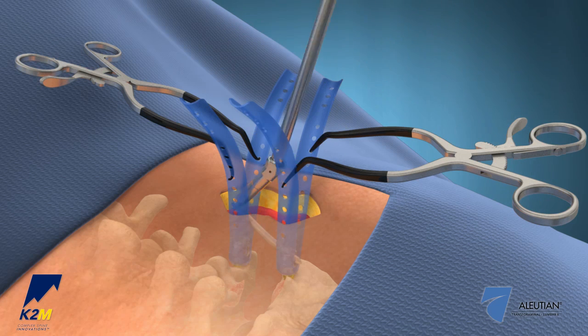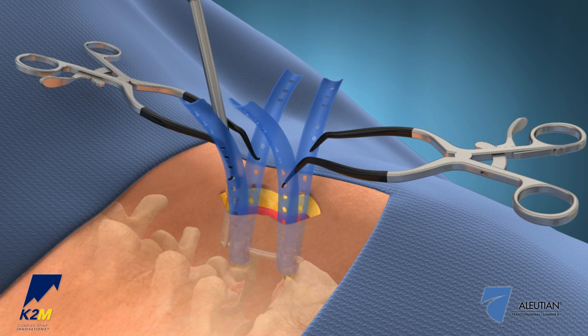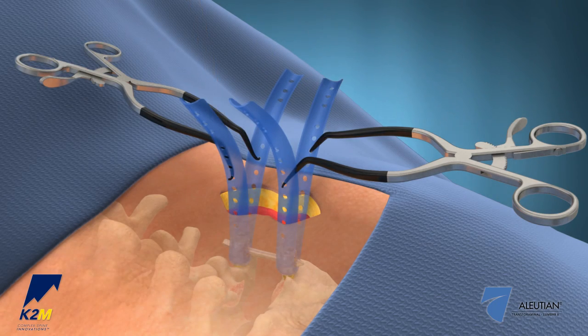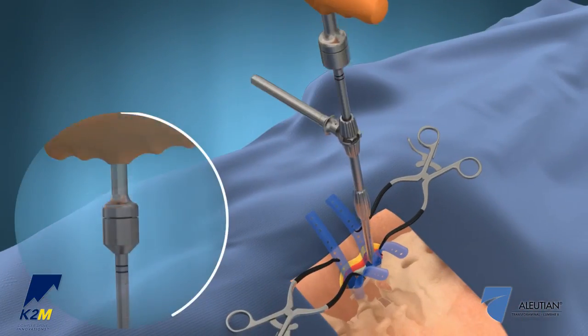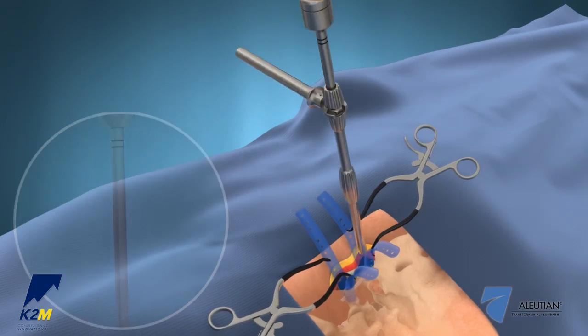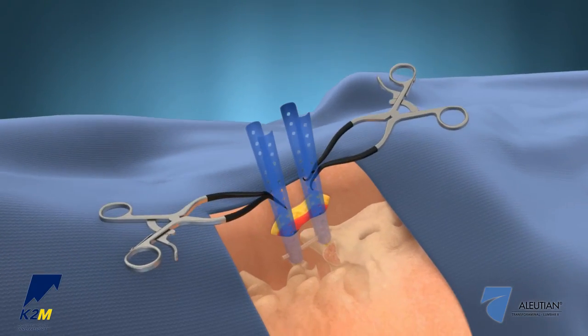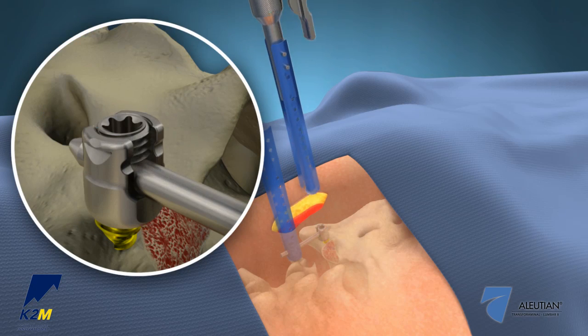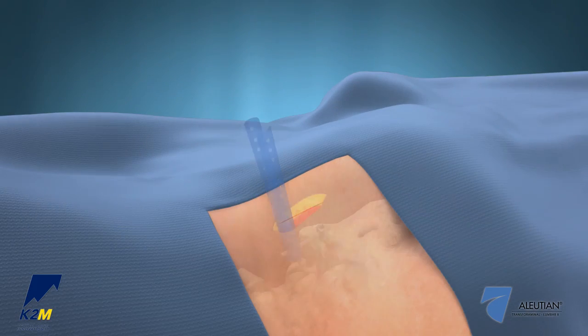Place the rod in the screw heads through the Serengeti retractors and lock it into position using the set screws. Compression and final tightening can then be performed. Finally, use the retractor extractor to remove the Serengeti retractors and perform a standard multi-layer wound closure.